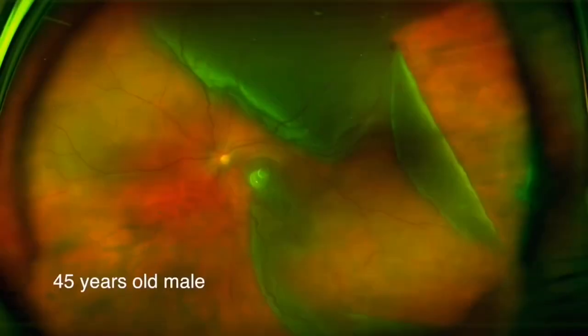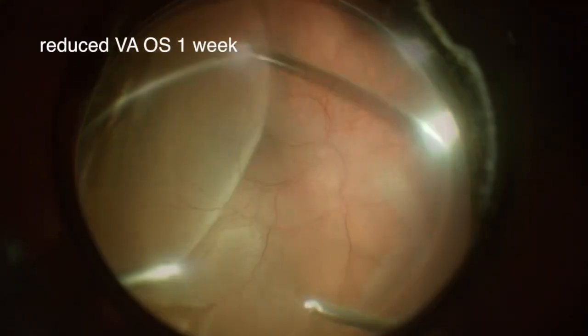In this video, we discuss the role of an encircling band with vitreoretinal surgery in cases of giant retinal tear. Some surgeons prefer placing an scleral buckle to support the vitreous base and reduce the risk of recurrent retinal detachment in cases of giant retinal tear.